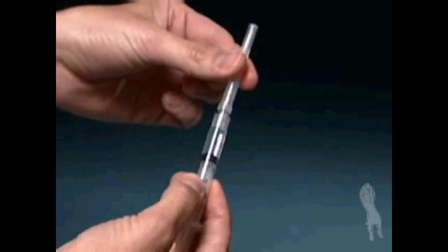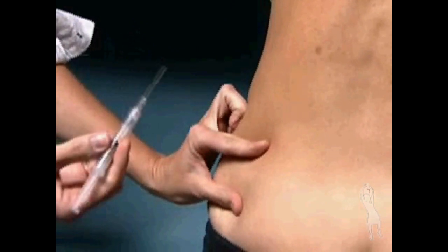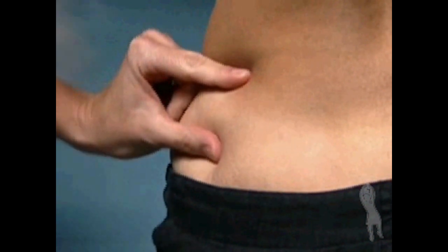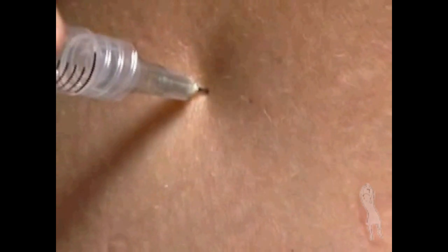Uncap the injection syringe. Hold the syringe the way you would hold a pencil. Use the thumb and index finger of your other hand to gently spread the skin at the injection site. Insert the entire length of the needle in a quick, dart-like motion at a 90-degree angle, straight in.